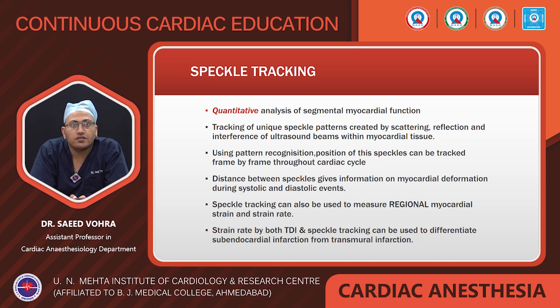In speckle tracking, unique speckle patterns are created by scattering, reflection, and interference of the ultrasound beam within the myocardial tissue. Using pattern recognition, the position of the speckles can be tracked frame by frame throughout the cardiac cycle. Distances between the speckles give information on myocardial deformation during systolic and diastolic events. Speckle tracking can also be used to measure regional myocardial strain and strain rate. Strain rate done by tissue Doppler imaging or speckle tracking can be used to differentiate subendocardial infarction from transmural infarction.